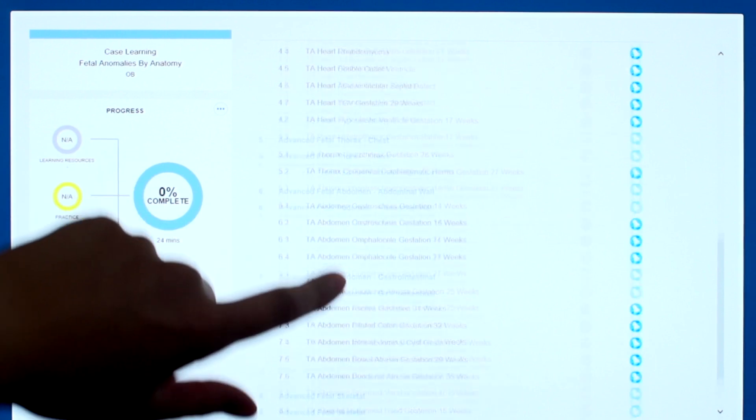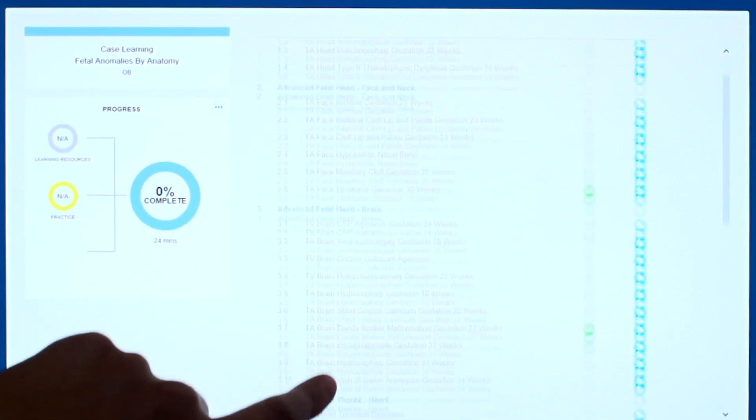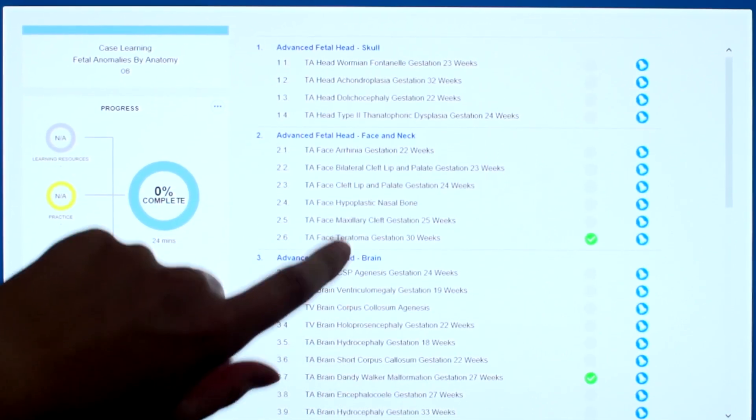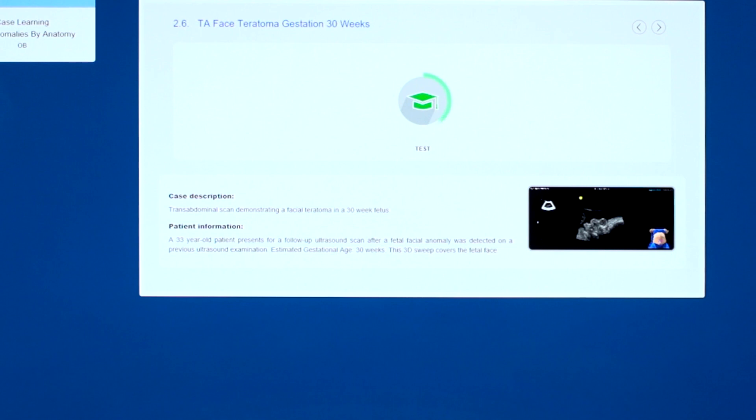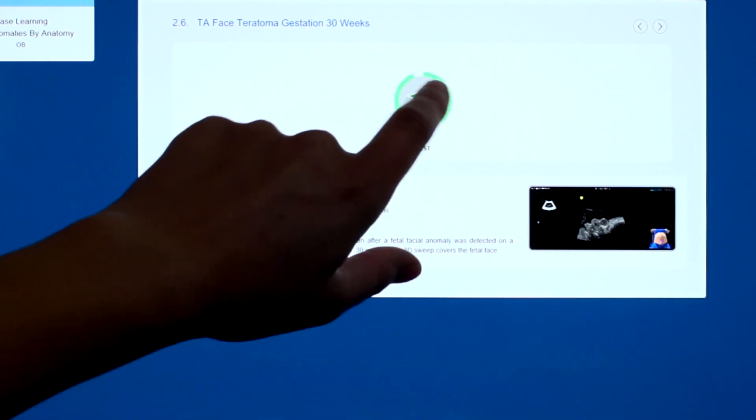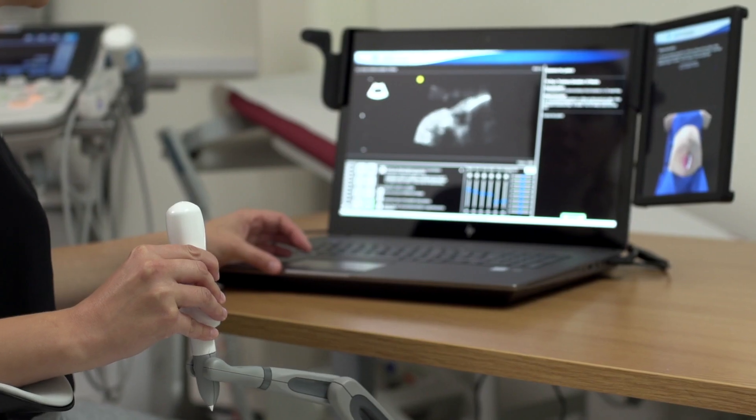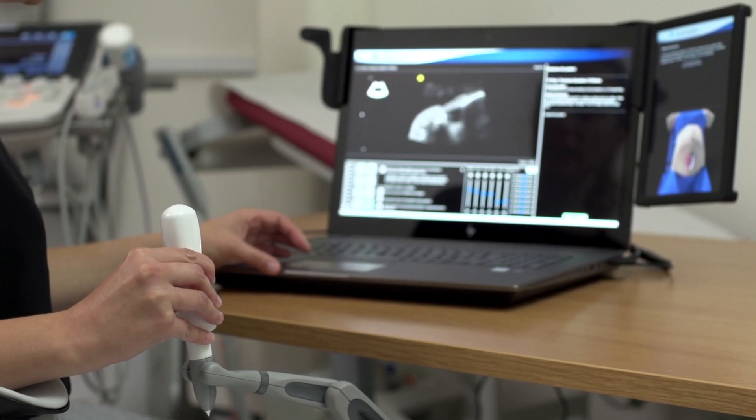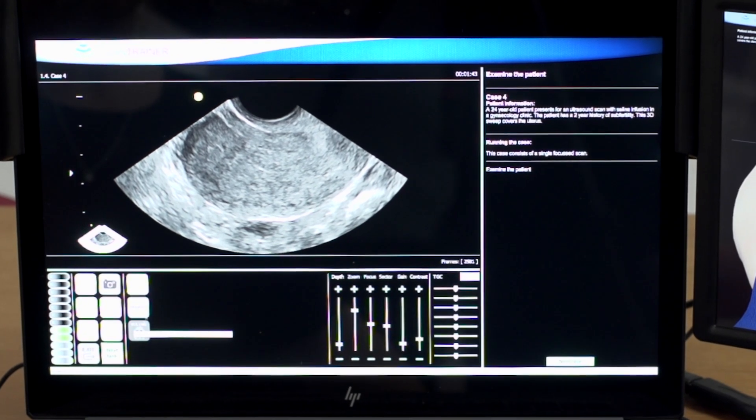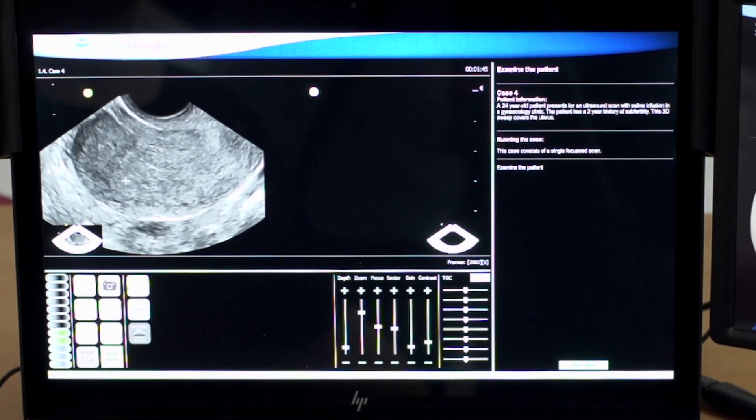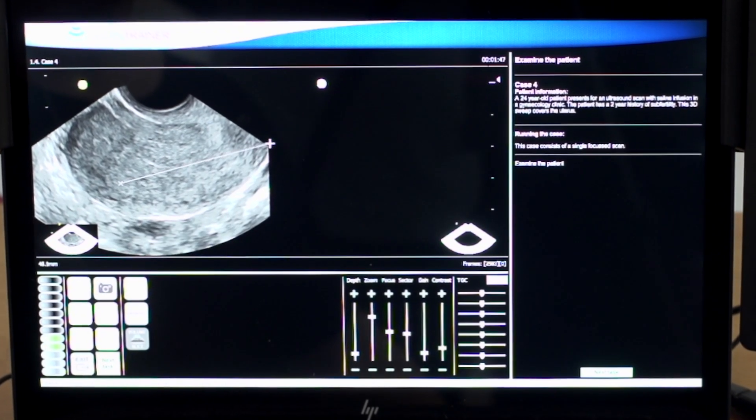ScanTrainer Examine contains obstetrics, gynecology, general medicine, and emergency medicine courses, which cover typical and rare patient cases to support core learning objectives. These courses also contain basic and advanced exams to test diagnostic skills.